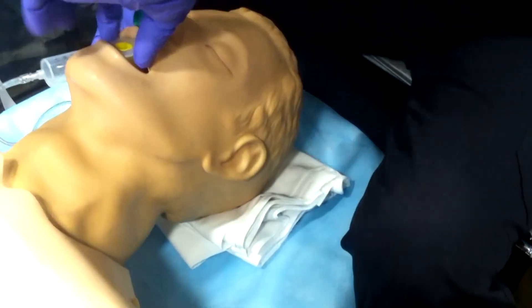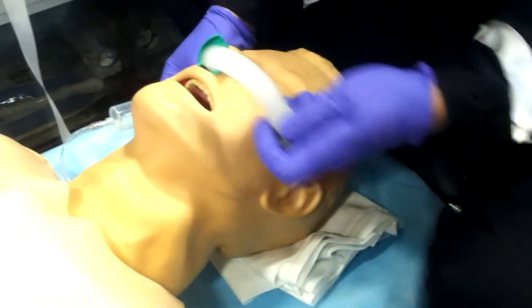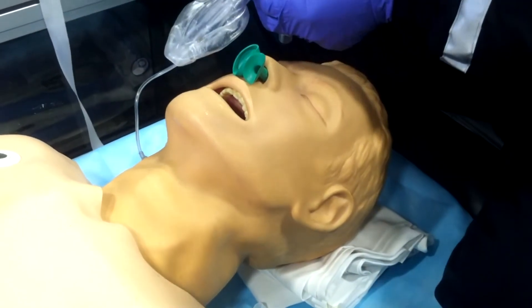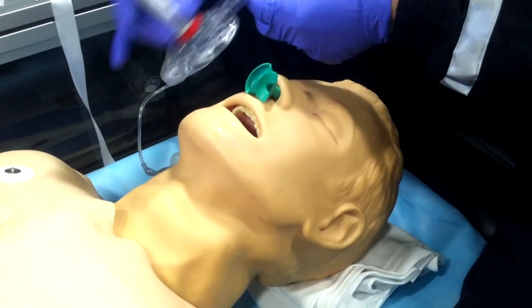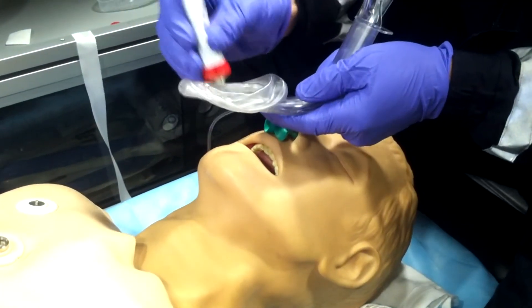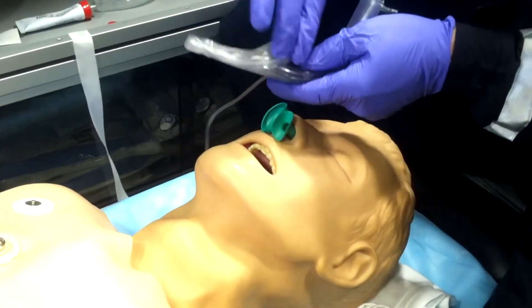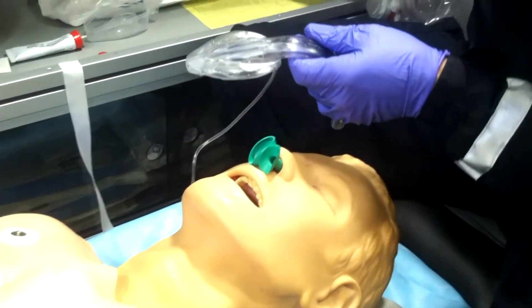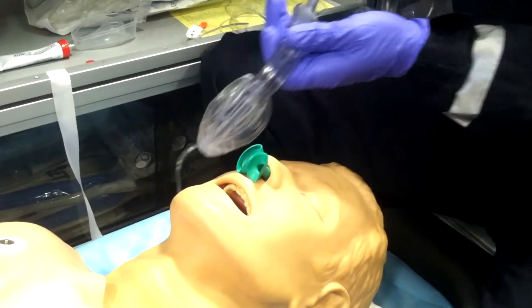Just prior to placement, remove the OPA and lubricate the posterior aspect — and even up the tube a little — as well as the anterior aspect of the airway. Prior to placing any airway, make sure you have your ET CO2 attached before insertion.